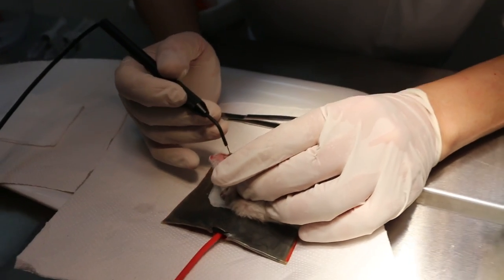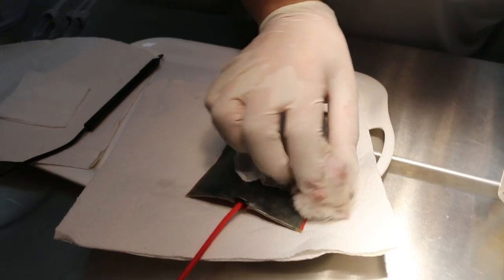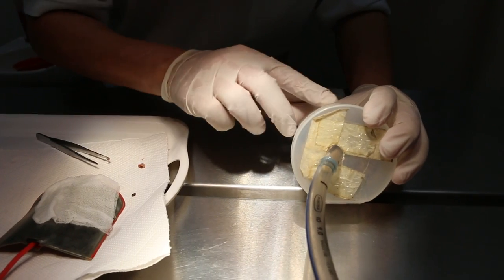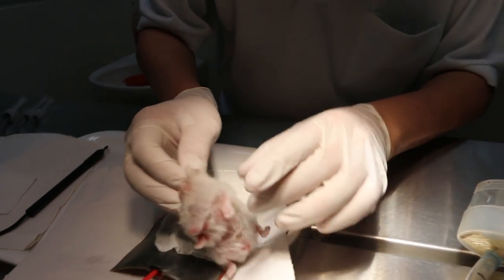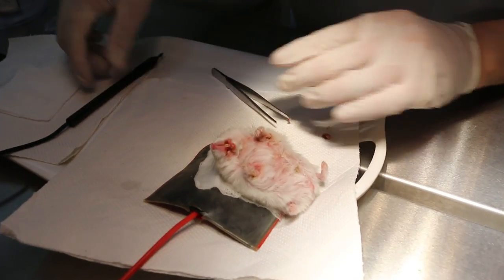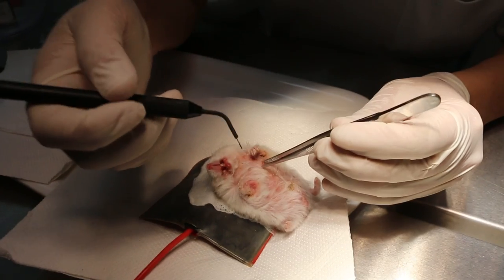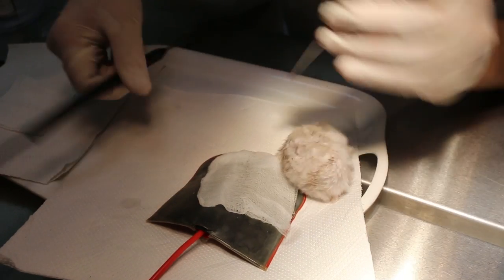Now this abscess, I can just lance it. It's difficult to see it up here. A bit more gas. 1, 2, 3, 4, 5, 6, 7, 8, 9, 10. Should be enough. Okay. So then down, and as you can see, there's another wart here as well. So I have to remove this wart also, otherwise it will grow bigger. So just slice it off.